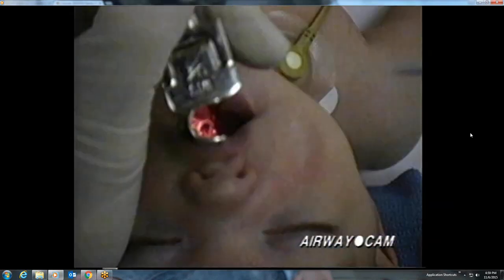The infant epiglottis is relatively large and horseshoe-shaped. The posterior cartilages are also relatively larger in the infant. Even though the straight blade is being used, the tip of the blade must be in the vallecula, because otherwise the epiglottis would not be seen.